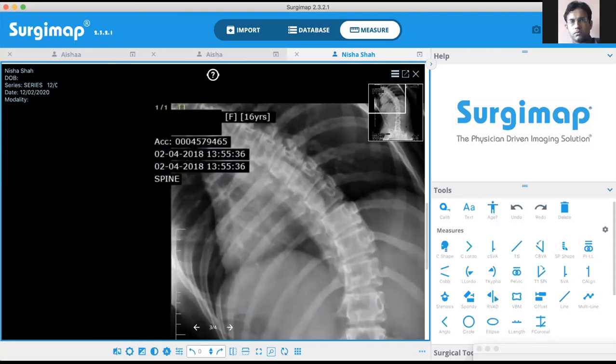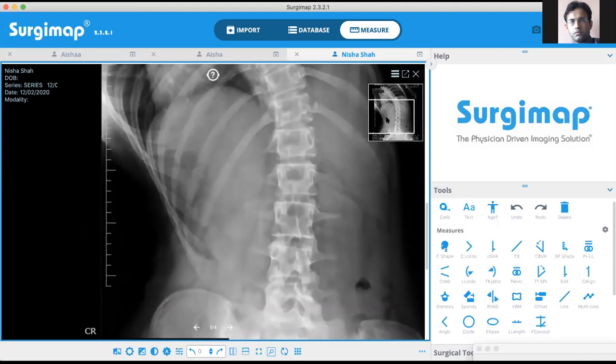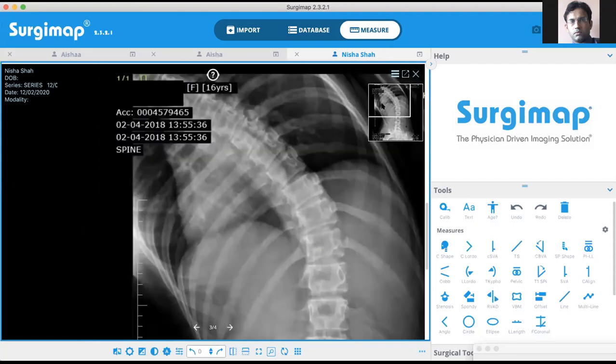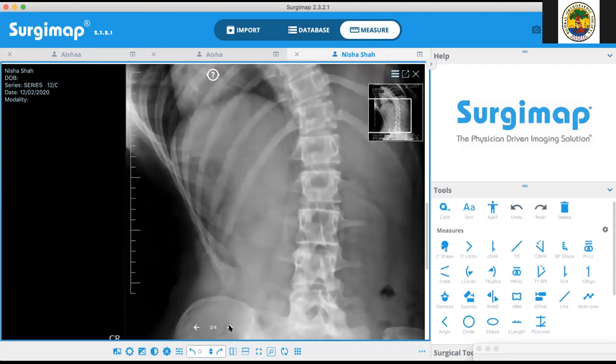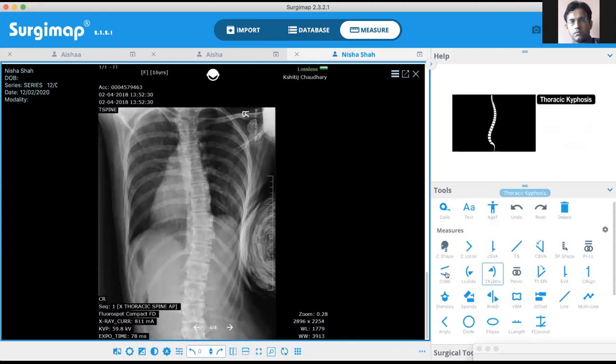See, there is a lot of information being hidden here. We are not able to see our T5. So this bending was meant for the left lumbar curve. We can go over here, but again here we can count from below. 12 for the main thoracic, 9, 7. So this is our T5. Let's bring our curve in picture. That's T5. That's our line over here.